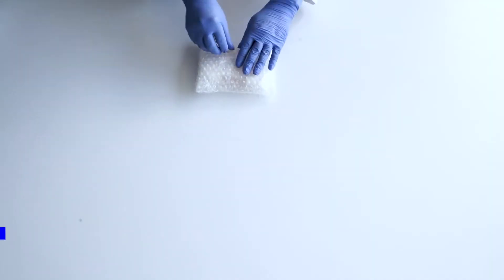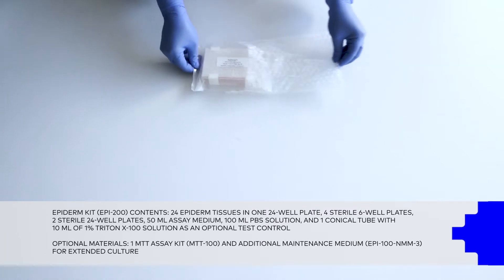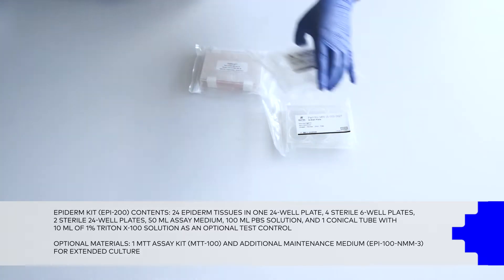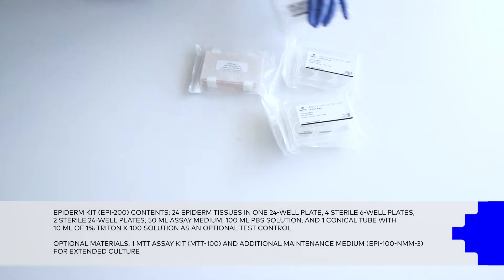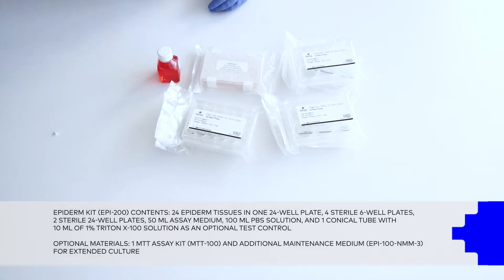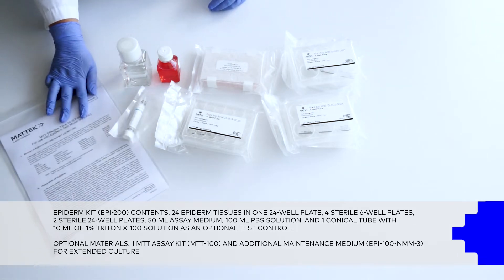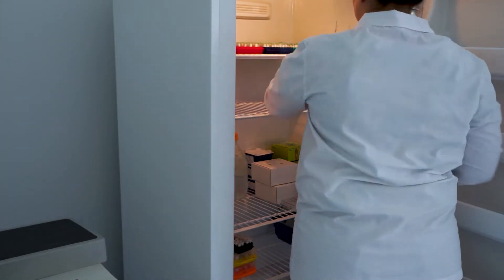Store the Epiderm tissues and assay medium in the refrigerator, maintaining between 2 and 8 degrees Celsius.